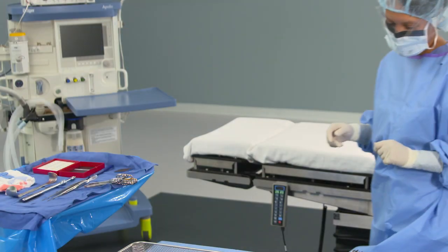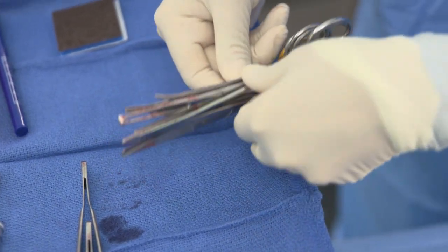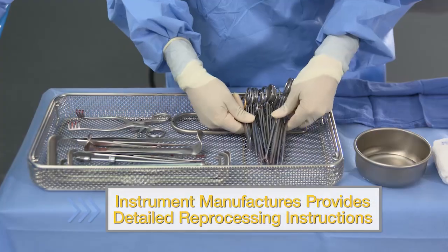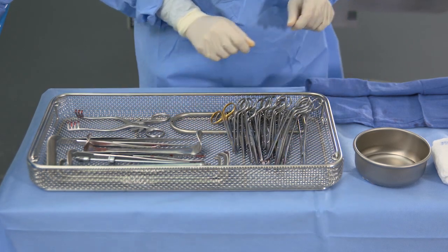Post-procedure, an OR staff member should be responsible for initiating the decontamination process at point-of-use locations. The device or instrument manufacturer is required to provide detailed written instructions for the full reprocessing cycle, including any pre-cleaning or disassembly directly after use.